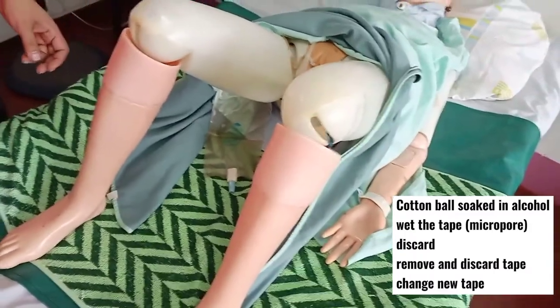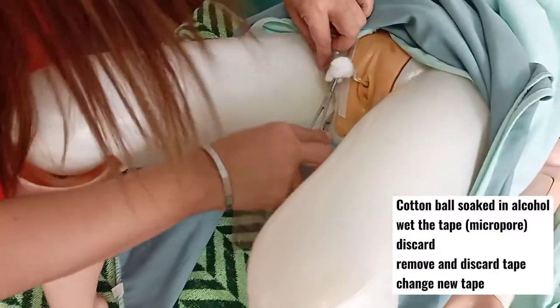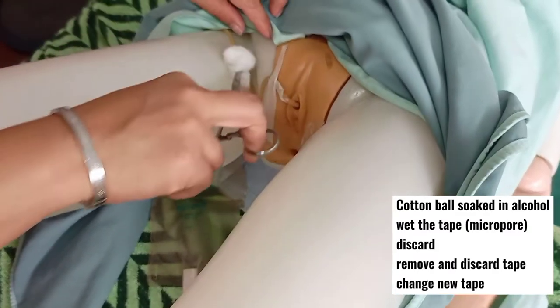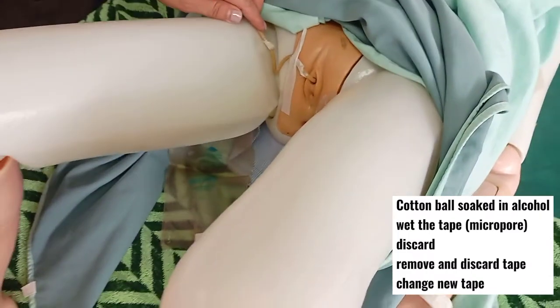Get another cotton ball soaked in alcohol to soak the other tape, discard, then change the tape to new ones.